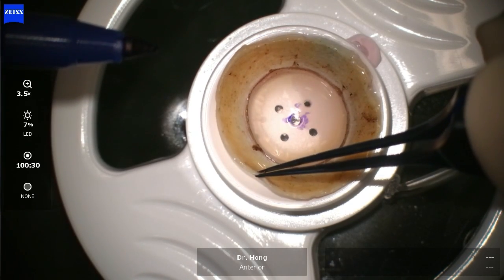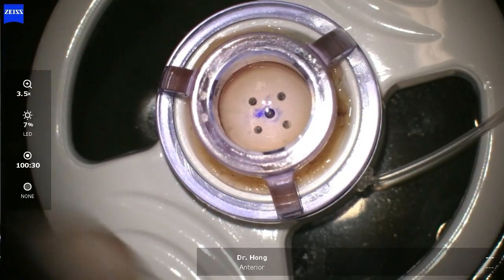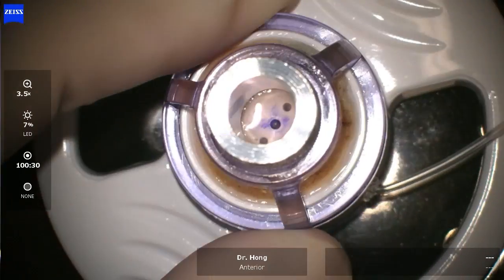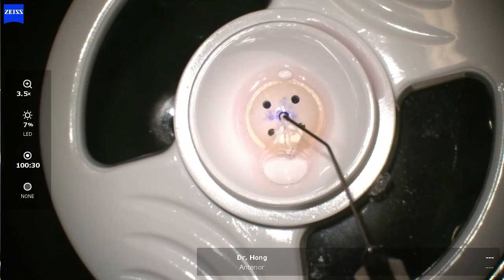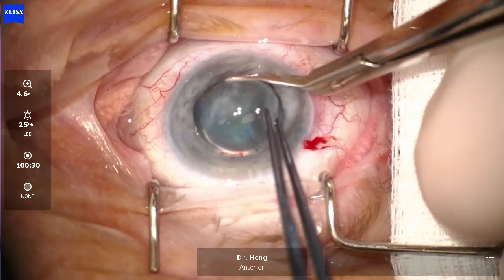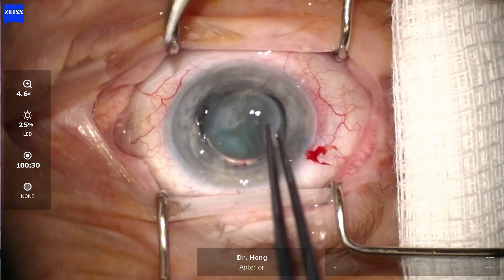The donor tissue was first inspected under the microscope. It was then placed on the Barron trephine and an 8.5mm trephine was used to create a punch. Viscoelastic was used to protect the endothelium and the rest of the cornea was then removed with corneal scissors.